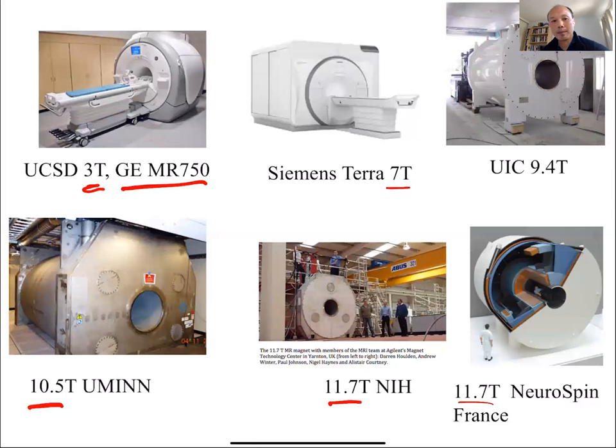So we'll talk a little bit about why people keep building bigger magnets. But the main reason is, as we'll see, you get more sensitivity as the magnet field increases.